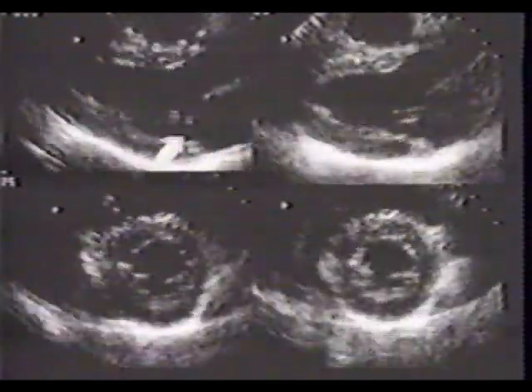This is particularly valuable for the post-exercise study, where pronounced respiration may completely obscure images from all but a few cycles. Note that all left ventricular segments displayed thicken normally. Contractility is more vigorous on the exercise study than on the resting study, which is the normal exercise response.